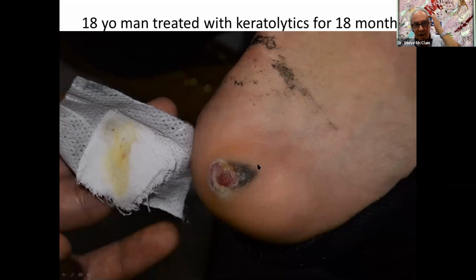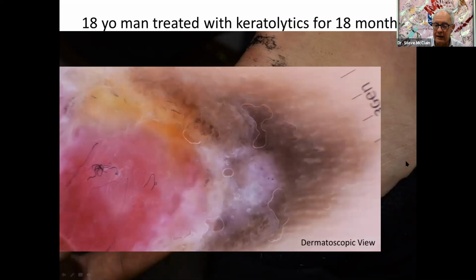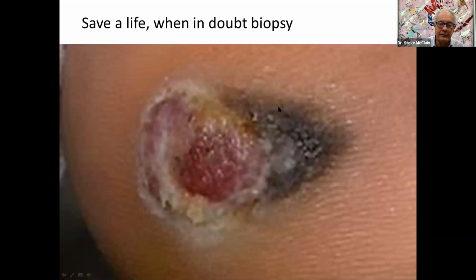This young man is a sad case, 18 years old, was treated by podiatrist 1, and then he retired, and podiatrist 2 took over. So for a total of 18 months, this lesion was treated with keratolytics. This pigmented lesion off to the side is melanoma, and this young man died from metastatic melanoma at the age of 20. If he'd only had a dermatoscope put on it, you'd see the pigment is on the ridges. The ridges are risky. If we look, there's a furrow right here. The furrows are not pigmented so much, but you look at the edge of the lesion. So when in doubt, biopsy.